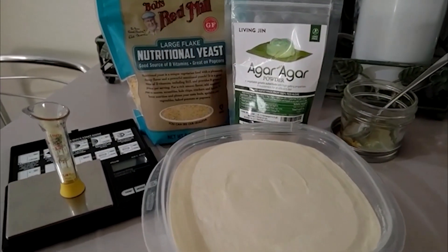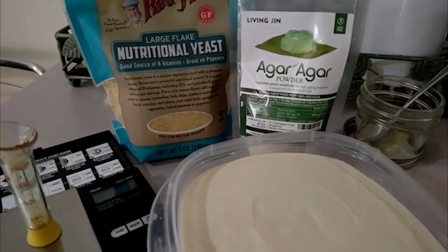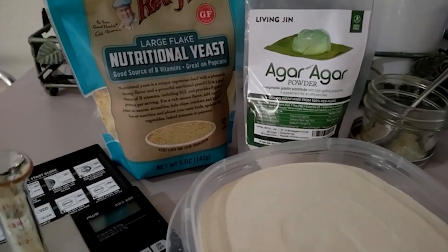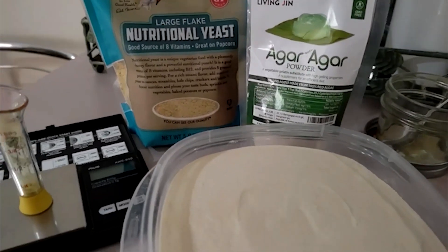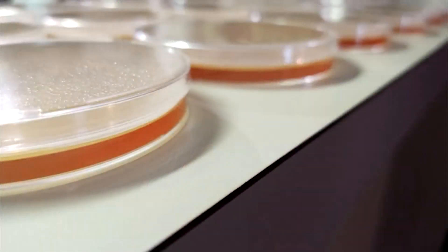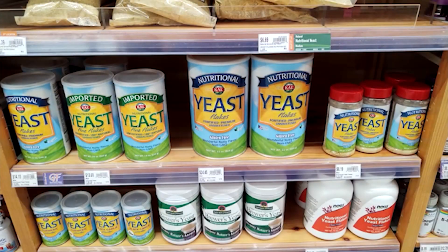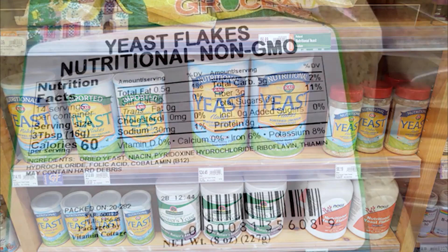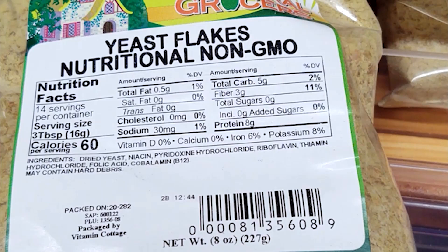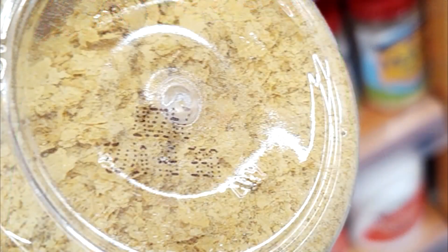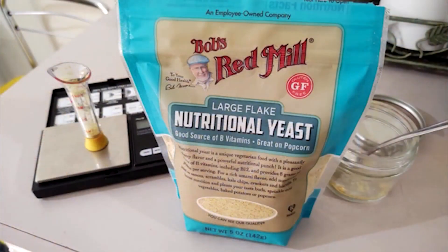MYA, or malt yeast agar, is an amazing agar recipe. This recipe provides the perfect nutritional source from the malt extract, but the addition of nutritional yeast will promote booming rhizomorphic growth in your mycelium cultures. Nutritional yeast can be found in most health stores or online in various forms from powdered to large flake. Both are good, but you want to grind it to as fine a powder as you can.